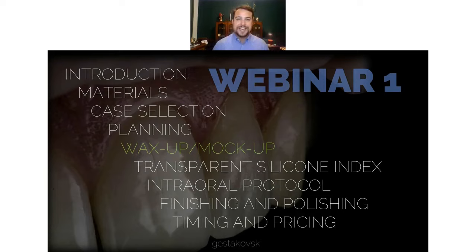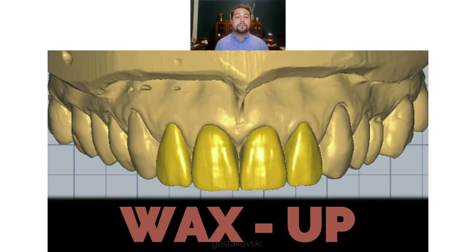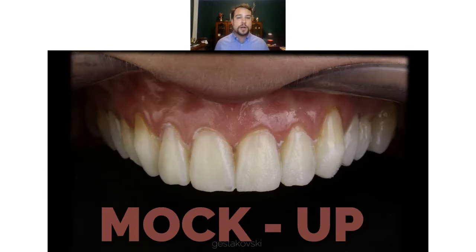My technicians design the wax up. About the wax up, you can go for the analog or for digital. In the analog, you will have more ability for micromorphology. With the digital, you will have some other advantages which will speed up your procedure. But the best thing is, here you have the wax up, then you try the mock-up. And in the mock-up, you check everything: function, phonetics, aesthetics, all the important stuff. And when you do the veneers, they will look the same. This is the most important.